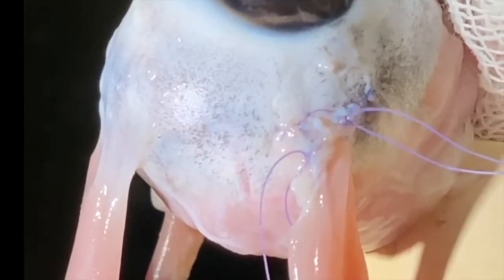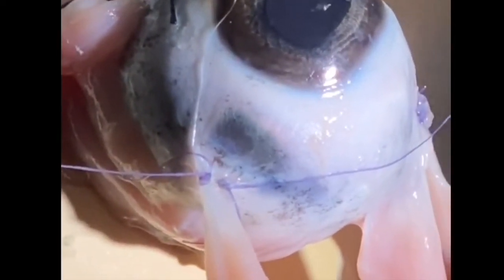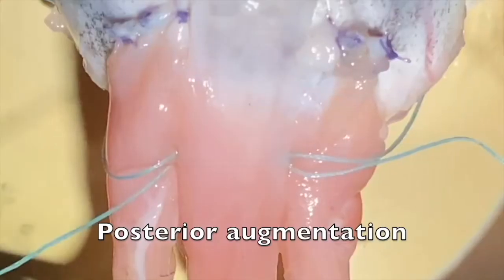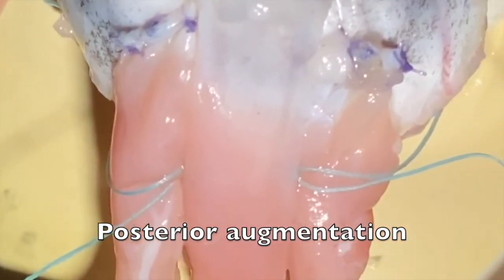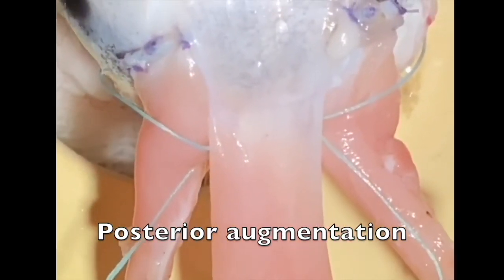For performing full thickness transposition surgeries, 3 recti muscle are simulated. The two horizontal rectus muscle are secured with sutures and disinserted. These are then sutured just adjacent to the vertical rectus insertion to complete the procedure. Here we have also demonstrated placement of posterior augmentation sutures using 5-0 ethibond.